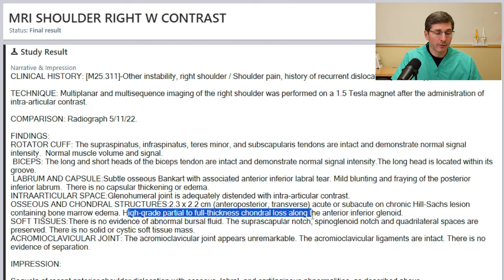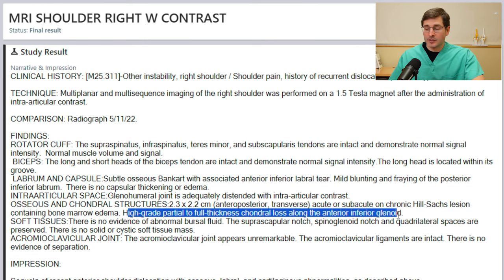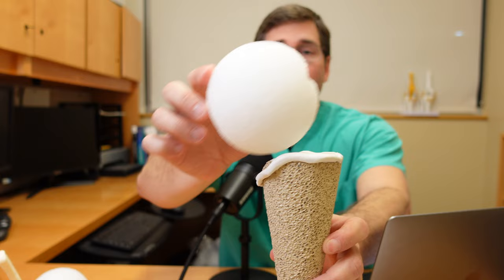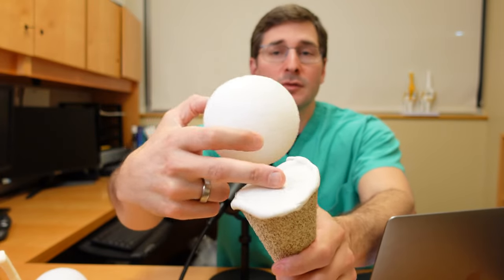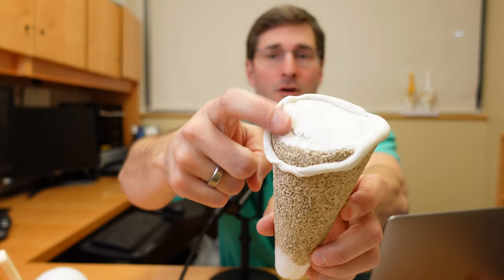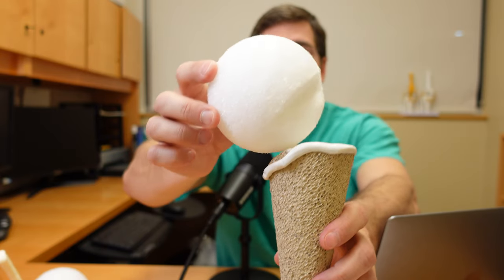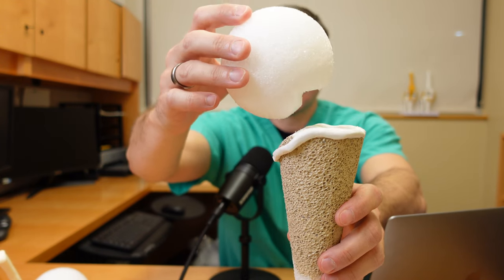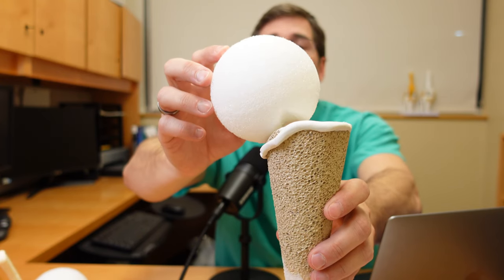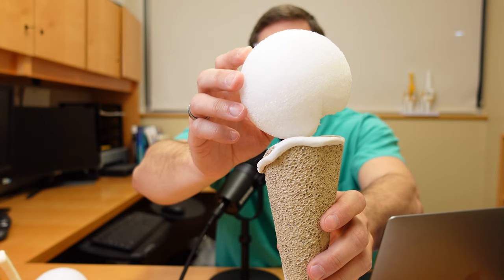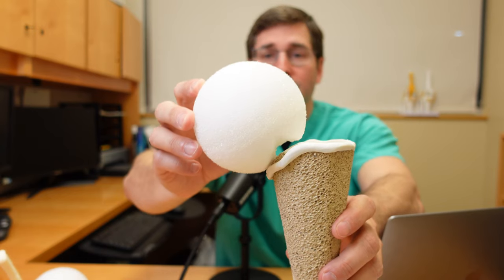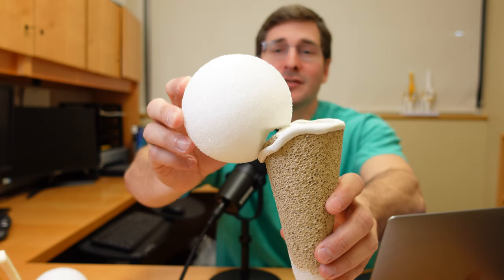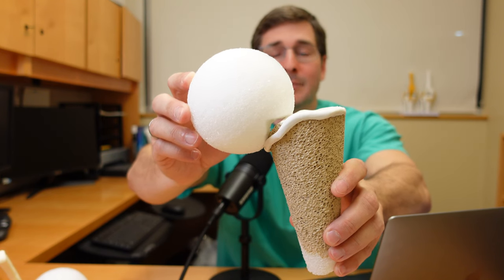They see high-grade partial to full-thickness chondral loss along the anterior inferior glenoid. You can see this patient's ball has been dislocating repeatedly, shearing off cartilage each time instead of gliding smoothly. Now there's a defect on the humeral head and a defect on the socket, meaning the ball has less room to balance on the socket. It doesn't take much then for the ball to hit the edge and dislocate again, and the defect on the humeral head can actually lock onto the edge of the socket, leaving the shoulder locked and unable to be reduced.